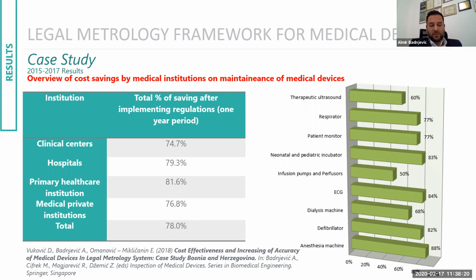Of course, the prices of testing medical devices, because it's established by the country, are much lower than the tests called attestations from the manufacturer and authorized distributors. For example, for the clinical centers and hospitals, we had more than 70% cost savings in a one-year period of maintenance of medical devices, which is a few millions for each hospital. That is something we didn't plan, but that was also the result.